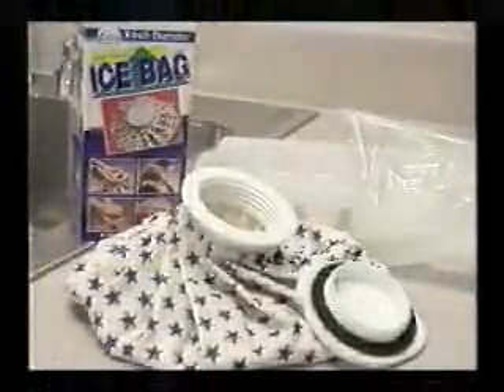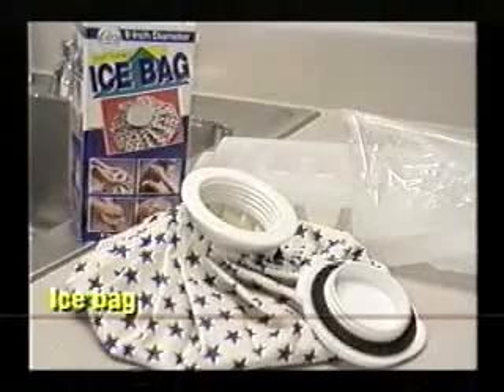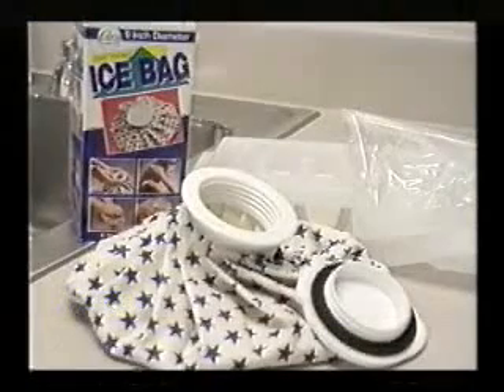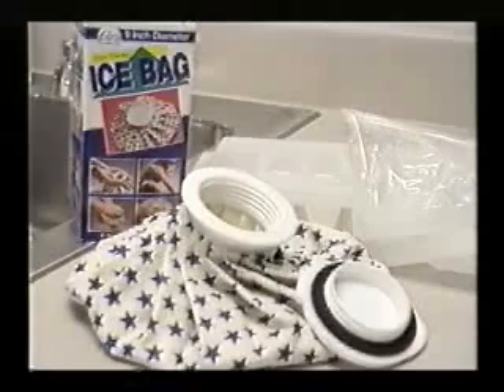You also might use an ice bag. An ice bag is a reusable, waterproof container that can be filled with ice, large pieces of ice, or ice chips, and it will help provide temporary local cold.